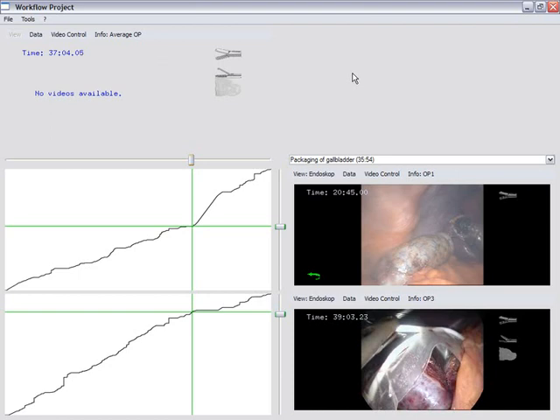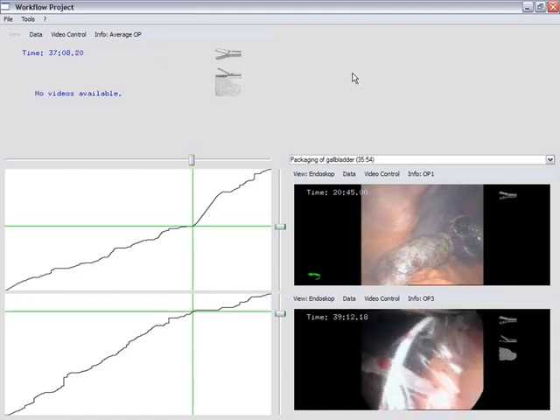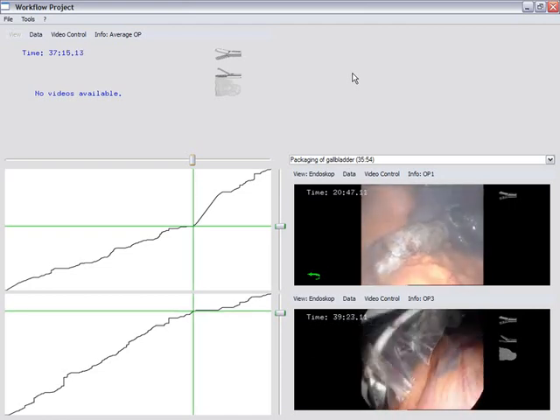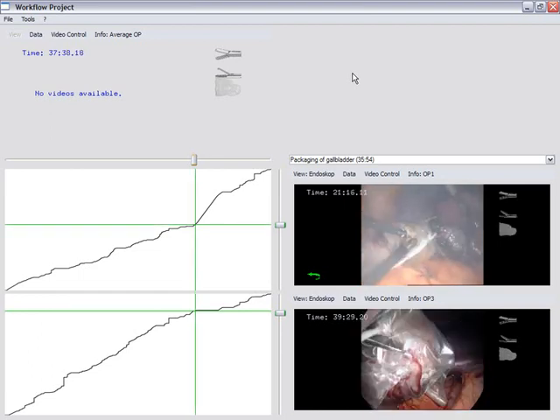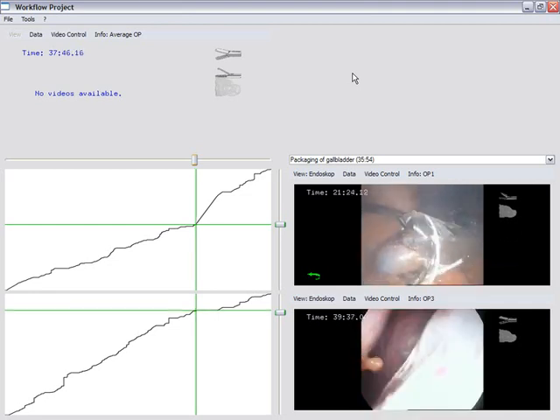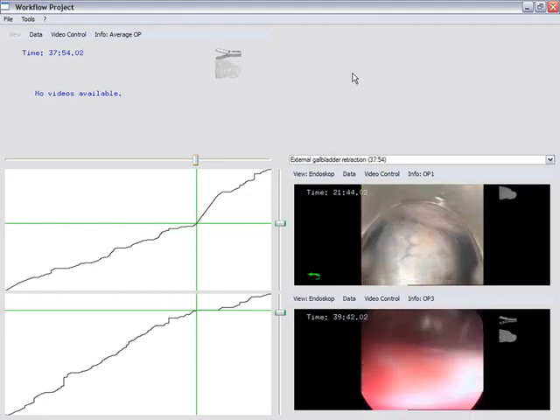The upper video demonstrates the performance of a senior physician with profound surgical skills. Since he needs considerably less time to package the gallbladder, the video freezes and waits so that the packaged gallbladder is shown simultaneously again. In contrast to the other surgeon, the guidance of the instruments is very precise, and he only needs 1 attempt for the packaging. This application is useful for education purposes and reviewing of surgical performance.